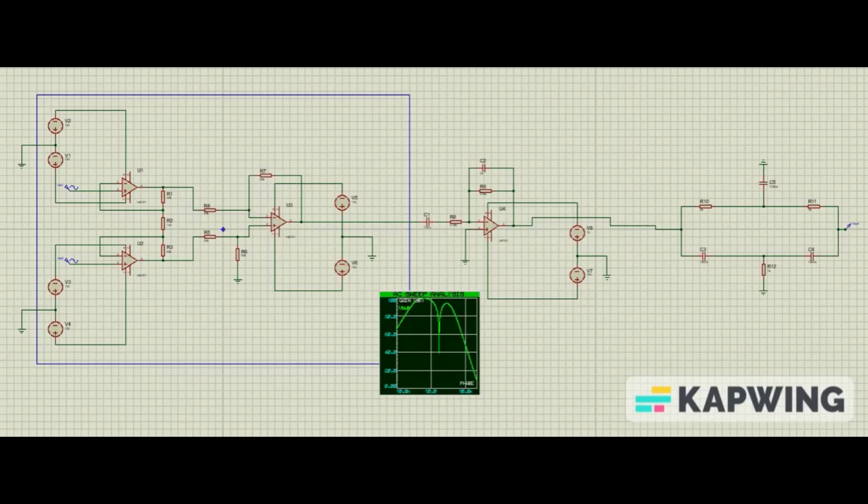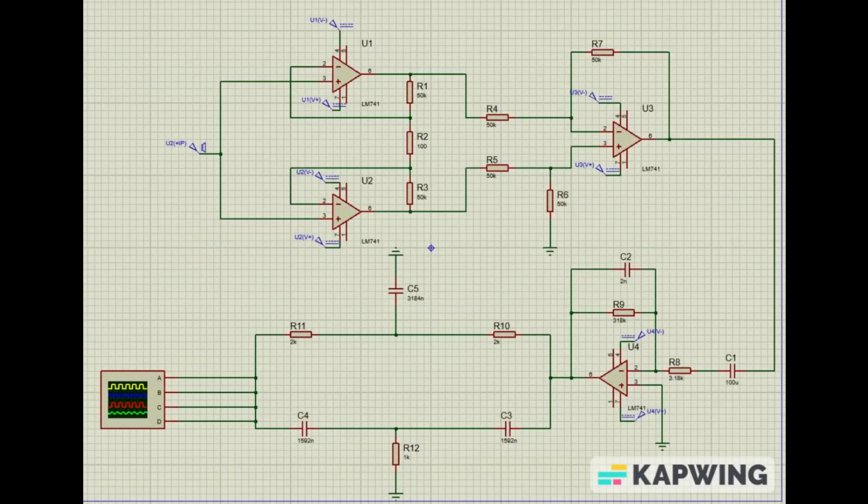Usually, amplification is done before filtration. So, as I mentioned earlier, the instrumentation amplifier was placed at the beginning. The band-pass filter amplifies the signal further, so it was placed second, before the notch filter, which only filters out a specific frequency. The entire circuit was also tested using an AC sweep simulation, which produced expected outcomes, including amplification within the range of 0.5 up to 250 Hz, except for the 50 Hz notch range, which was filtered out as intended. Our last step involves inputting and testing all signals.